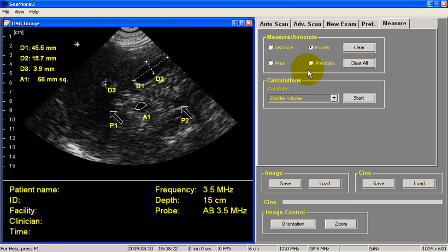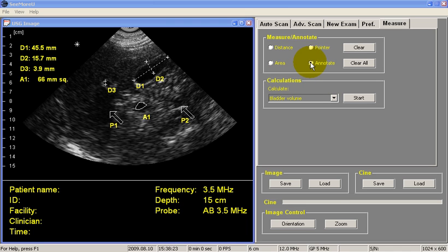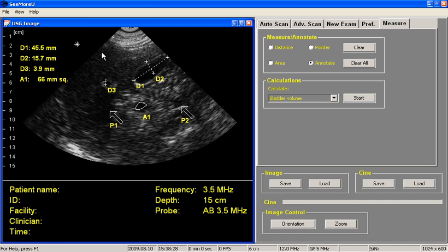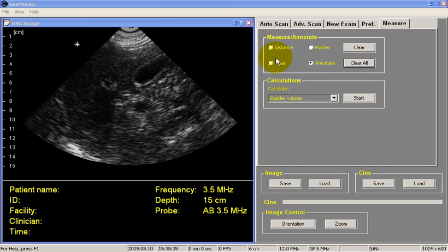And finally, for annotation, click on the Annotate button, we can right-click where we want to start typing, and I'll type 'liver', hit the Enter button, and there you go. We can clear all of this by hitting the Clear All button.